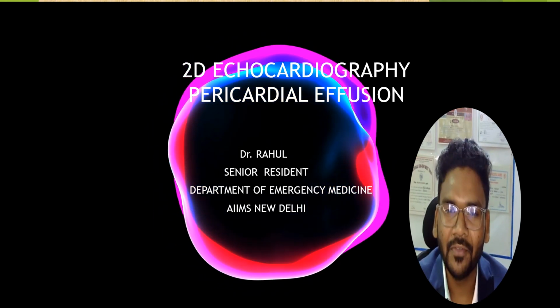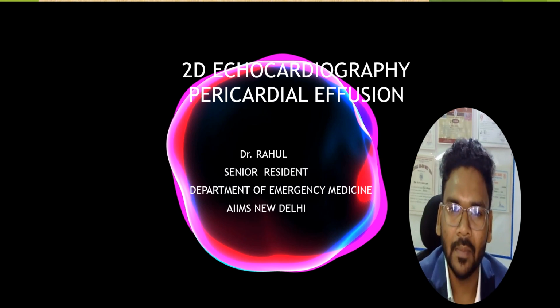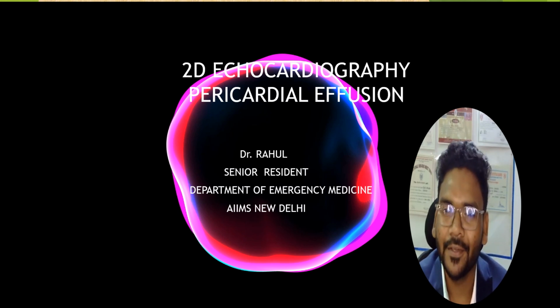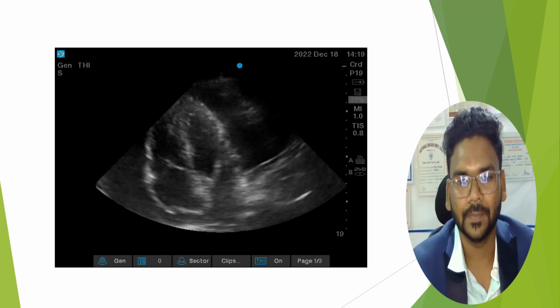In the previous session, we had discussed the basics of 2D echocardiography. So today we will talk about an abnormal finding of 2D echocardiography, that is pericardial effusion. I would like to start today's discussion with a case scenario.